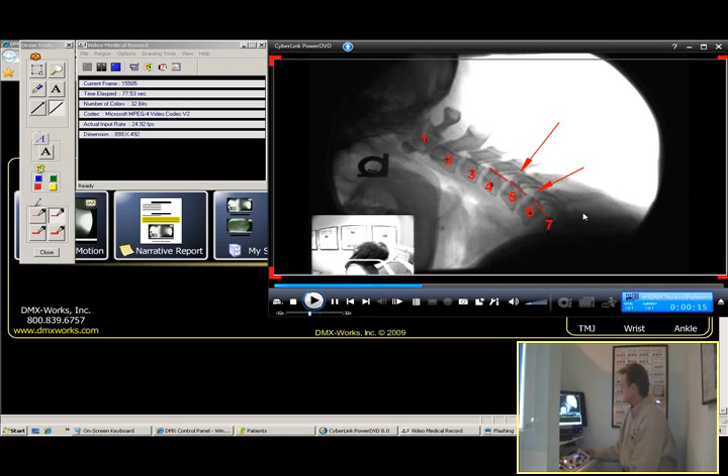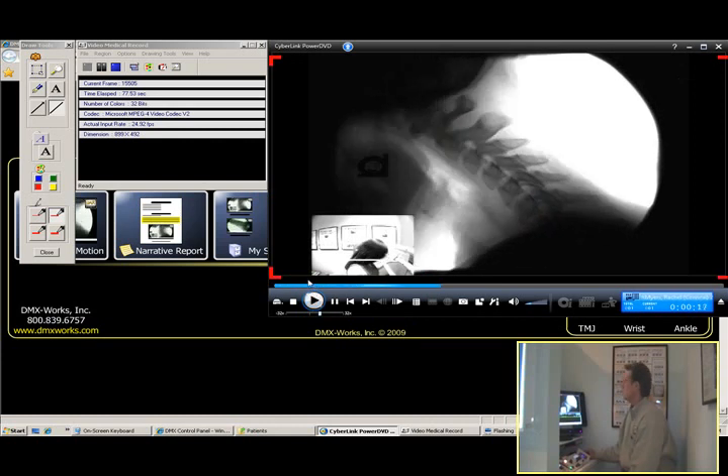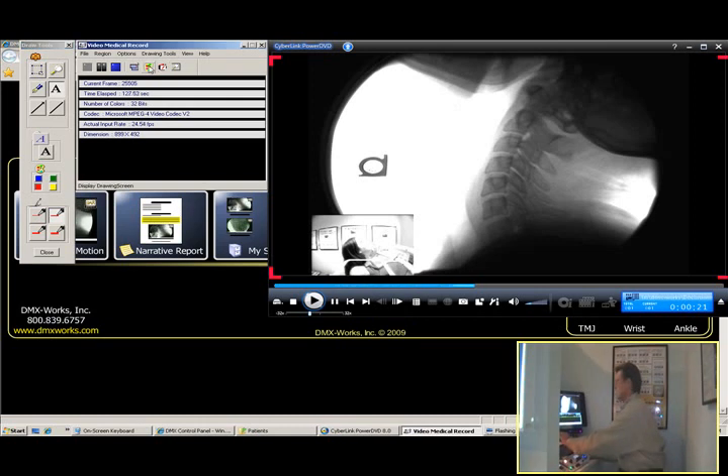We can see where the stair-step is on C5-C6. It's less on C4-C5 but still that's an indication that we've torn the posterior longitudinal ligament at these two levels. Now we're going to go ahead and continue the movie and have Rachel bring her head all the way up into extension, all the way. And I'm going to freeze it right there. Again, I'm going to come over here and number down the vertebrae so everybody can see it.